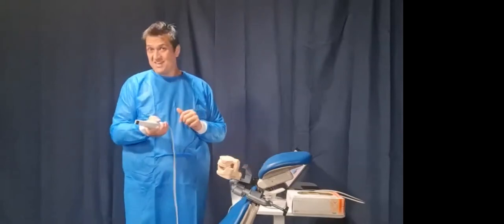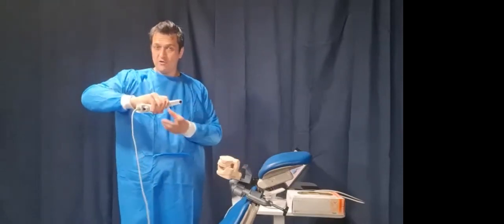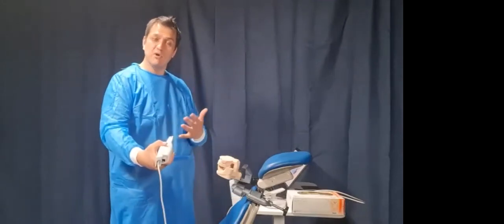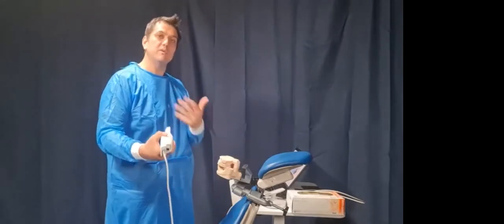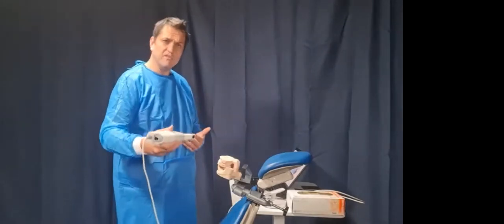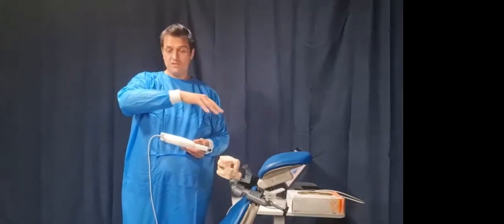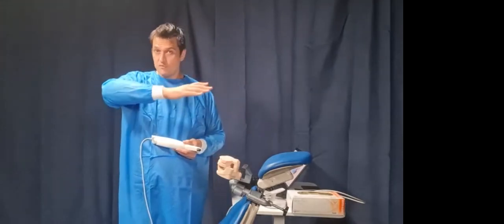Take the scanner out of the mouth. Flick your grip. Change your grip. Find your relocation point. Now, because you've scanned past the midline, you'll be able to find your relocation point, and you continue your scan from there. And once you get to the end of the upper, well, in this instance, the uppers, you start to move your way back to the center line, rolling, rolling, rolling, capturing as many indicating markers as you can.